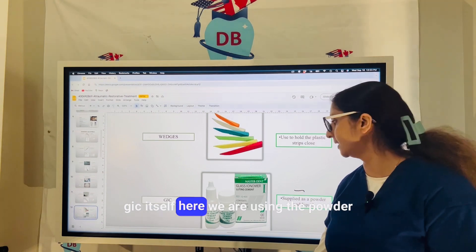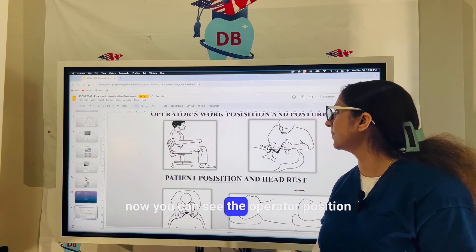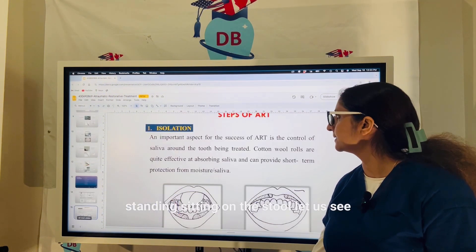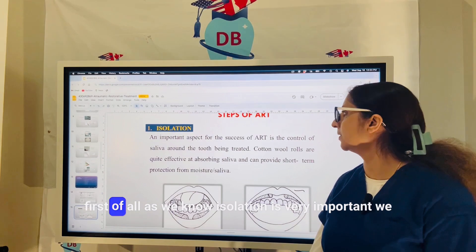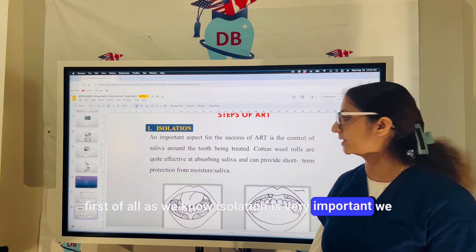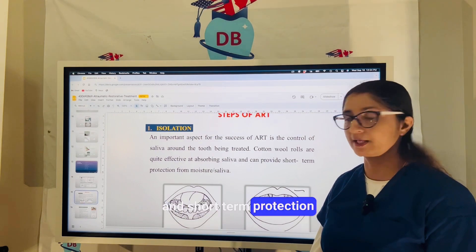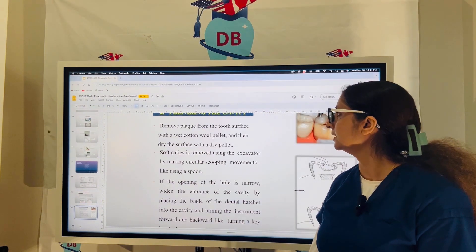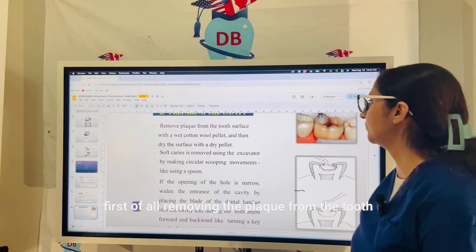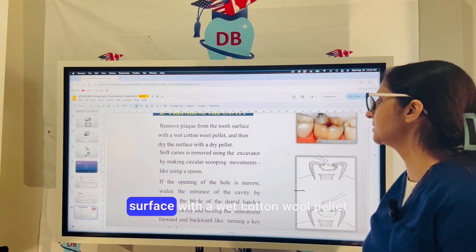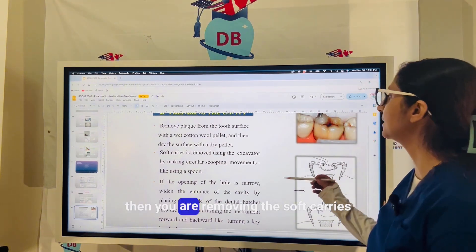The GIC used here is a powder-liquid system, self-cure type. The operator can be standing or sitting on a stool. The first step of the ART procedure is isolation — using cotton rolls to absorb saliva and provide short-term protection from moisture. For cavity preparation, plaque is first removed from the tooth surface with a wet cotton wool pellet, and then the surface is dried with a dry pellet.